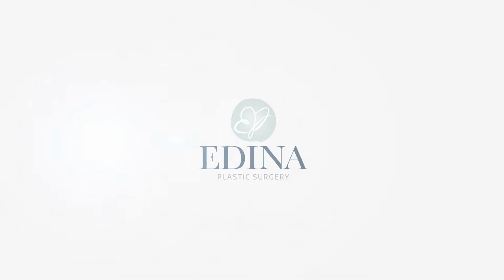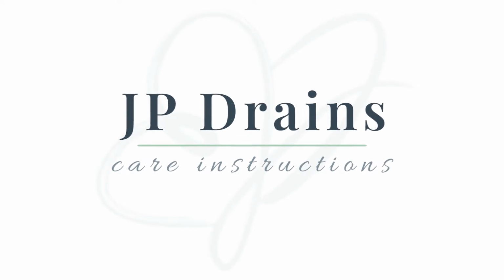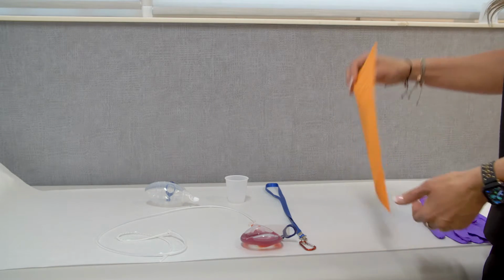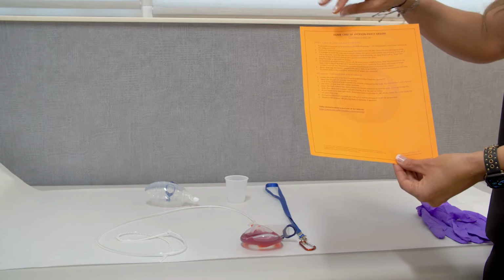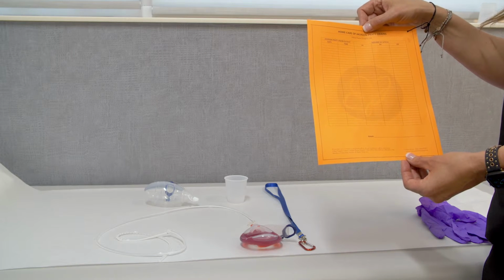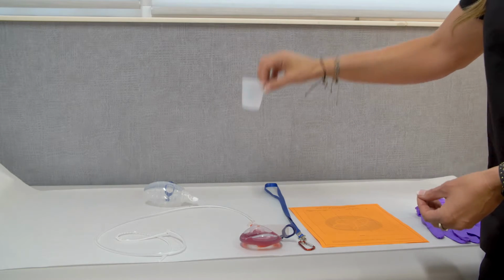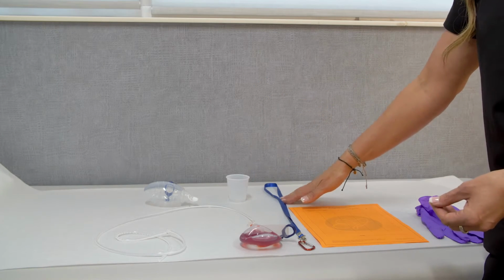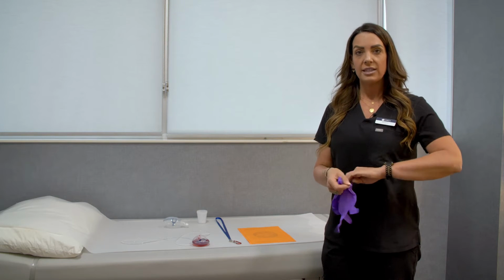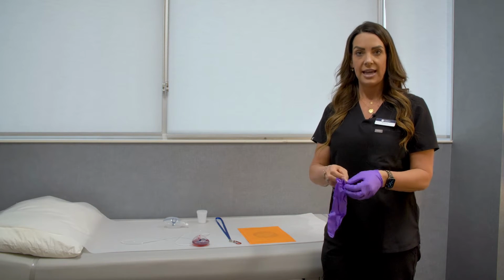Now, if you're sent home with drains after surgery, these are the instructions on how to take care of them. First of all, the supplies that will be sent home with you are an instruction sheet on how to do it, as well as an area where you document how much drainage comes out of the drains. You will also be sent home with a cup as well as a lanyard. If you have gloves at home, you can go ahead and use gloves. You do not need to wear them, but do make sure that you are washing your hands afterwards.